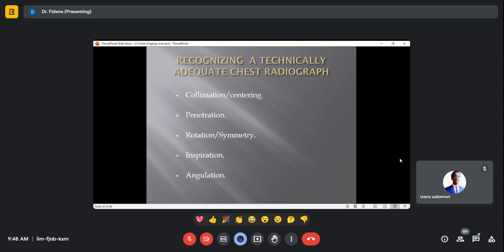But the first person who answered the question, if you want to mark him out of 10, how much are you going to give? It will be like 0.5. Actually 0, because his answer was meaningless. Okay, and that's the symmetry of the radiograph. In my exam, if I ask those kinds of questions and you answer that way, I don't know how much you'll get. Okay, so that's number 3.